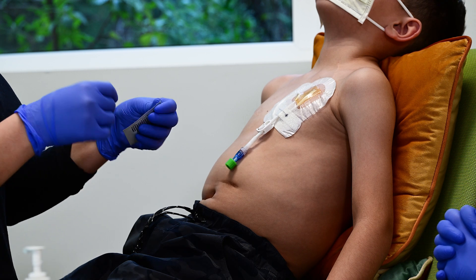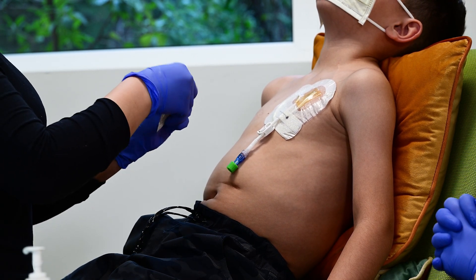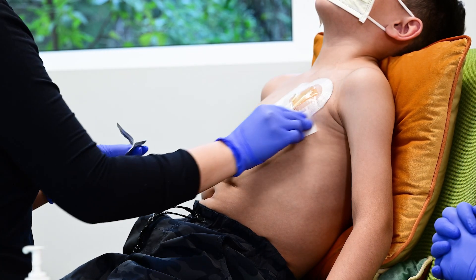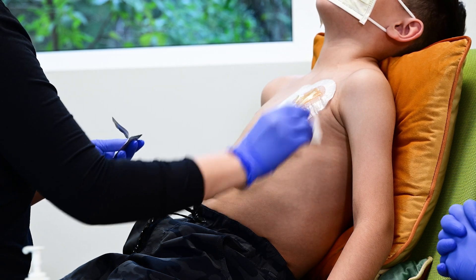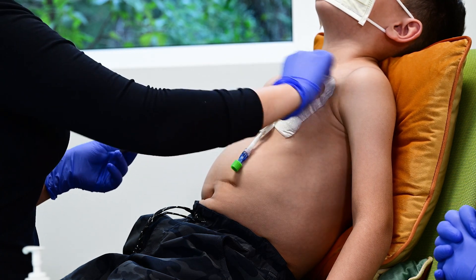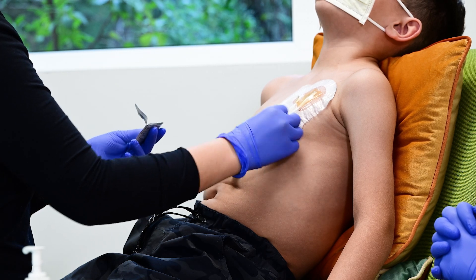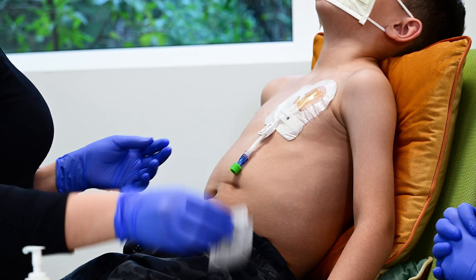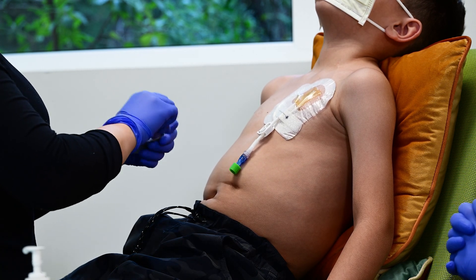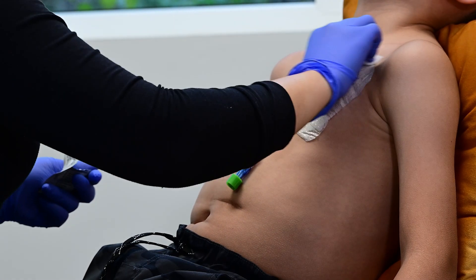Gently begin to remove the old dressing. Use plenty of adhesive remover to help the dressing come off without hurting your child. If needed, use an extra saline flush to put a few drops of saline to remove the CHG gel pad from the skin. It's important not to pull on the line. Never bring scissors near the line to remove the dressing. Some children have a hard time with this step because it can be painful to remove a dressing from the skin, similar to removing a band-aid. Go slowly and use your child's coping plan — this step should get easier over time.